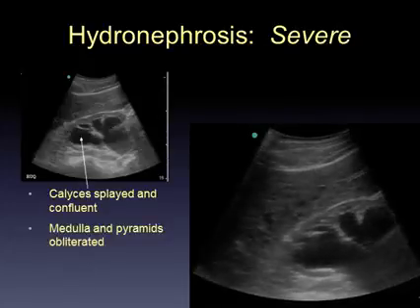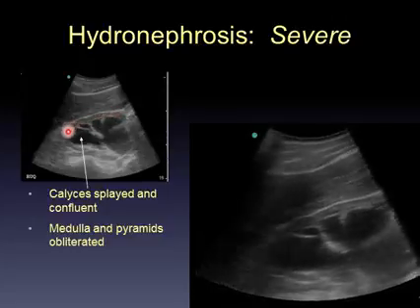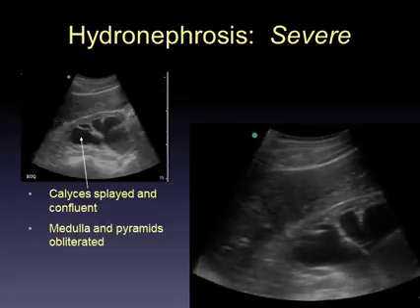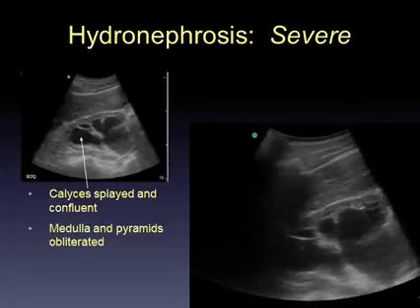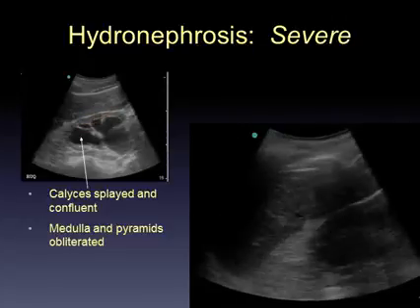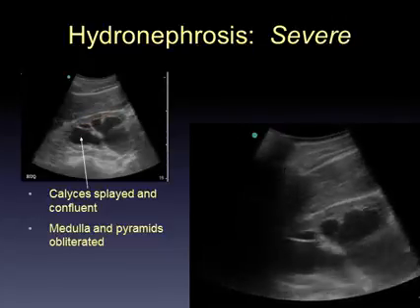Now the medulla and the pyramids are gone. You can maybe see there, where just underneath my pointer in that region was a collapsed, pushed down pyramid, but the cortex still remains. So we've probably got an acute situation here, not the chronic situation.